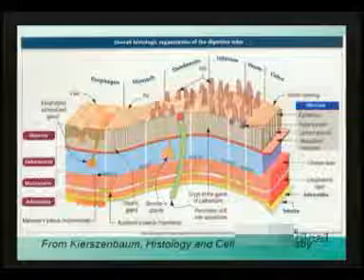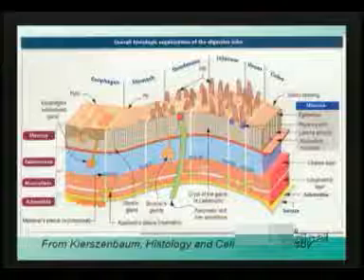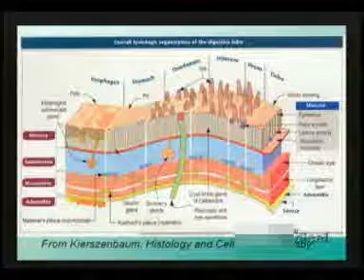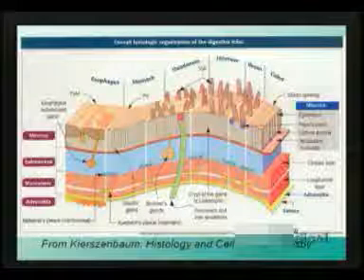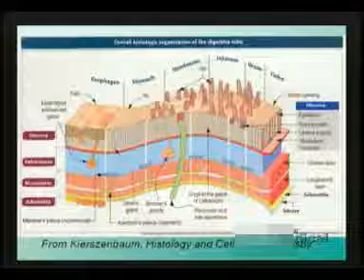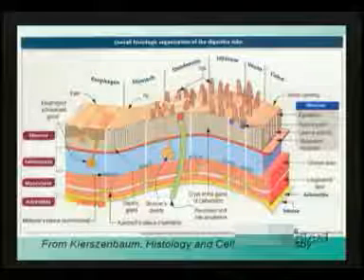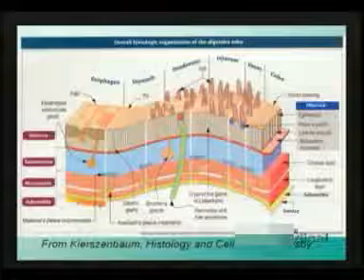The stomach epithelium begins our tour of epithelium that's basically thrown into pits and deep and shallow gastric glands, all lined by different functional elements of a simple columnar epithelium. Other than that, the underlying lamina propria and muscularis mucosa layer are unremarkable.